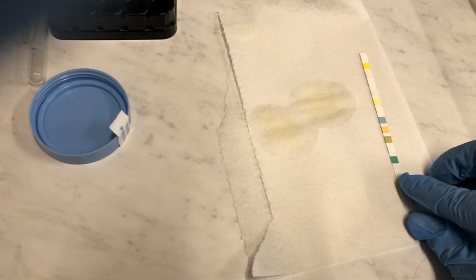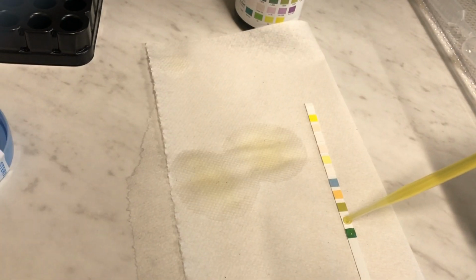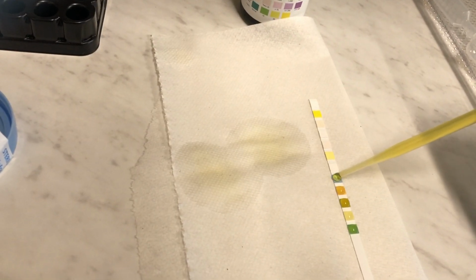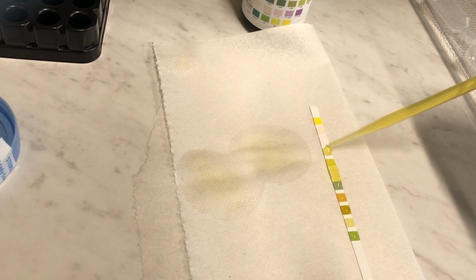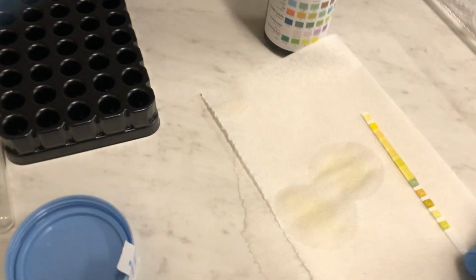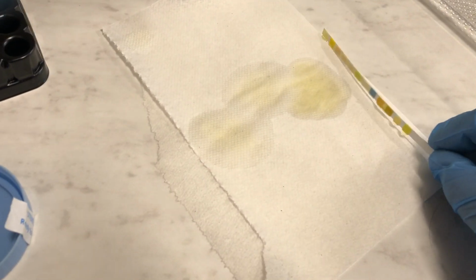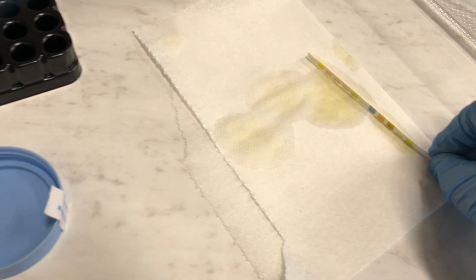All right, next we can come over and do our chemistry strip. So we take our pipette and we're just going to put a drop on each reagent pad. This does get a little bit messy, which is why I like to do it on a paper towel. And then after a couple seconds, when it's had time to absorb into the reagent pads, I usually like to tip it up on its side to blot off the excess.